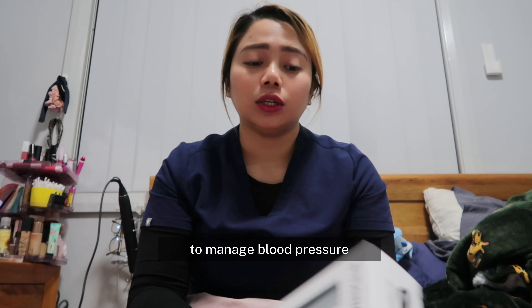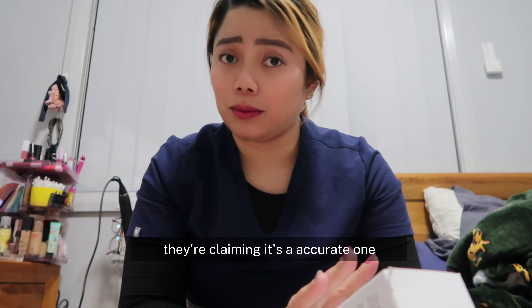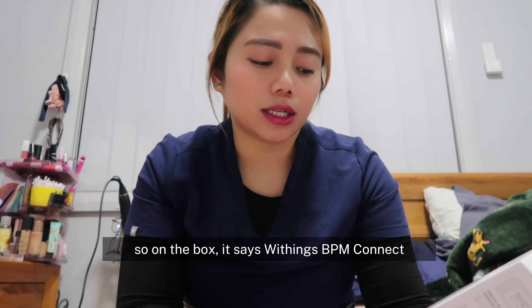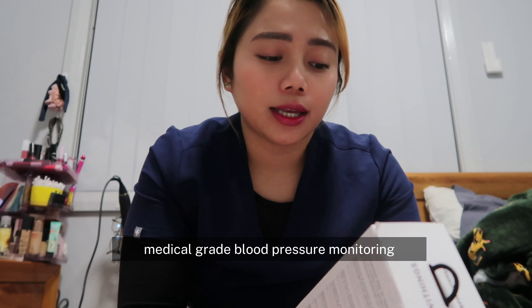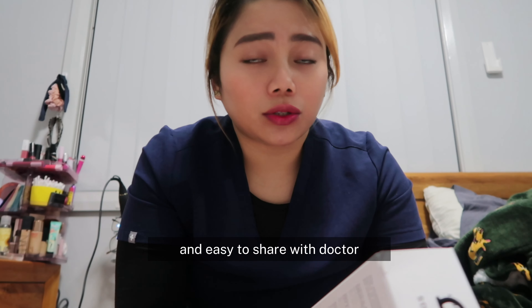So here it is — this is a blood pressure machine or the BP machine to manage blood pressure. I purchased this one at JB Hi-Fi. On the box it says Withings BPM Connect — clinically validated smart blood pressure monitor, medical grade blood pressure monitoring, personal hypertension journal, and easy to share with doctors.